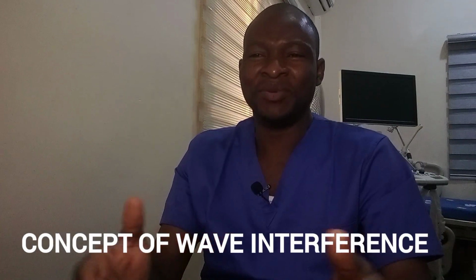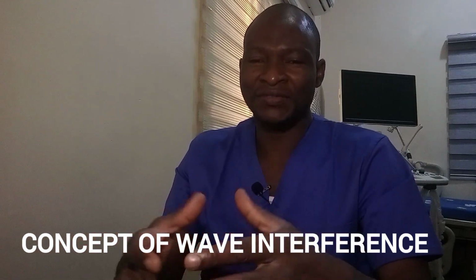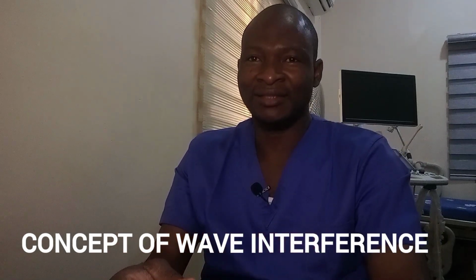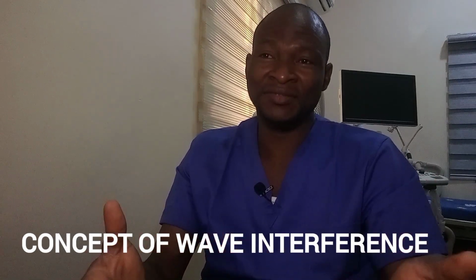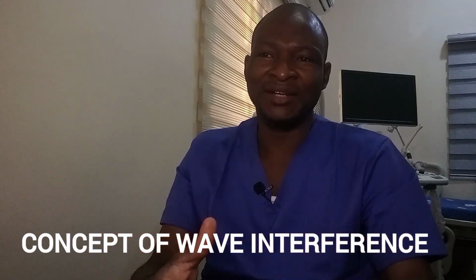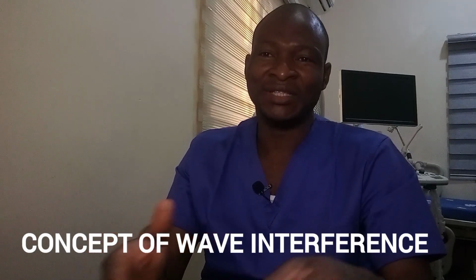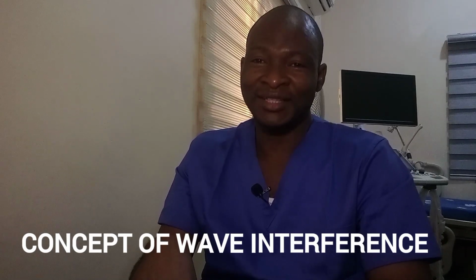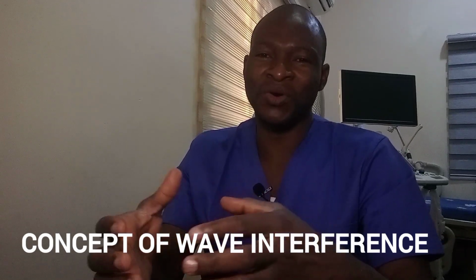Wave interference affects beam formation used in electronic beam steering, electronic focusing, Doppler instrument, and transducer matching layer design. Now, an acoustic wave is a repetitive cyclical variation of acoustic variables. So one complete cycle is divided into 360 degrees. The cycle begins at 0 degree and ends at 360 degree. The concept of phase is useful to describe the relationship between two or more waves.